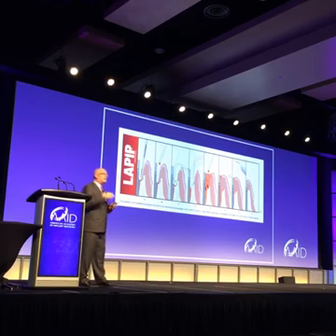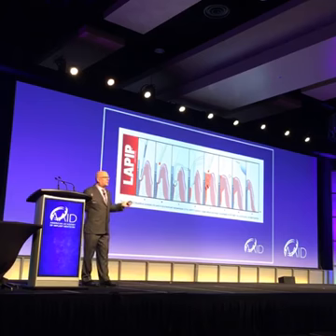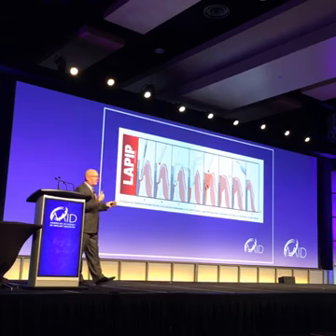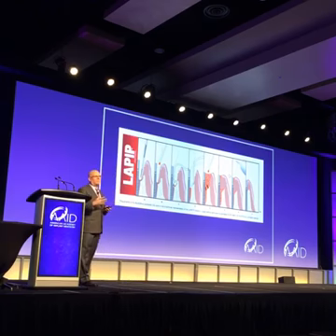We use the laser to remove diseased epithelium. This is interesting: we're not laying a big flap open like you would have to do with an erbium. We're still doing it in this type of procedure, just like the LAPIP protocol. We're removing diseased epithelium from around the implant, but we're not using the laser directly on the implant surface because you don't need to.